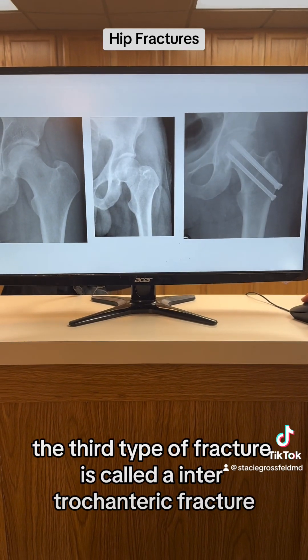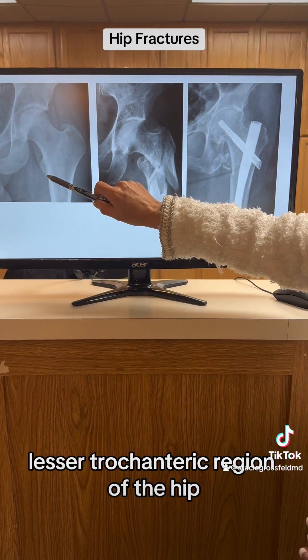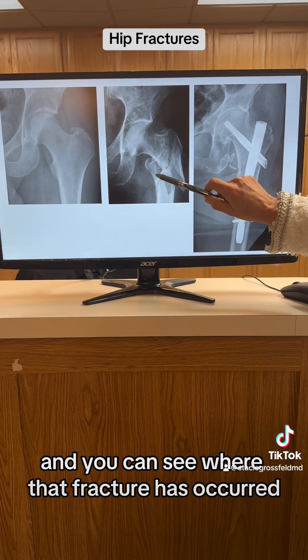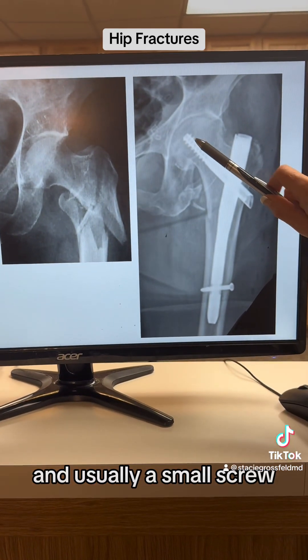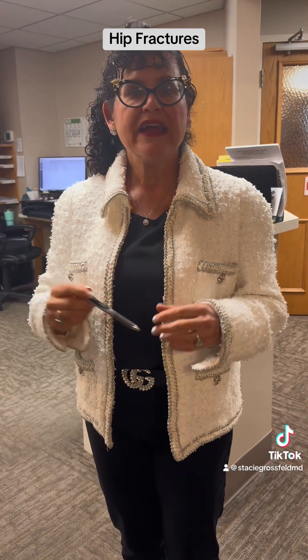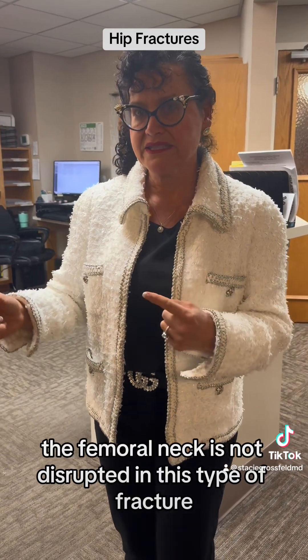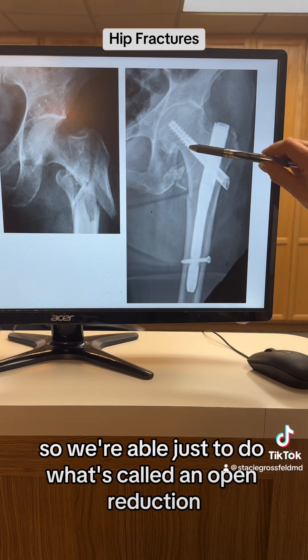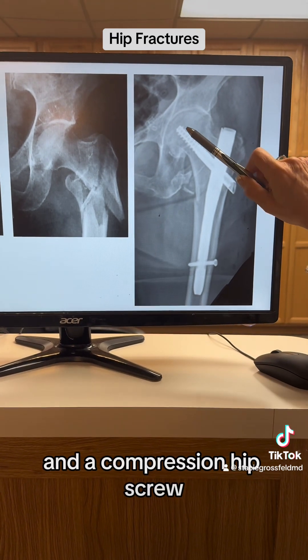The third type of fracture is an intertrochanteric fracture. The femoral neck looks normal, and you can see the fracture has occurred between the greater and lesser trochanteric regions. We treat this with a small rod and usually a small screw. We don't need a hip replacement here because the blood supply travels through the femoral neck, which is not disrupted in this fracture. The femoral neck is still intact, so blood vessels are still feeding the femoral head. We perform an open reduction or percutaneous pinning with an intertrochanteric rod and a compression hip screw.